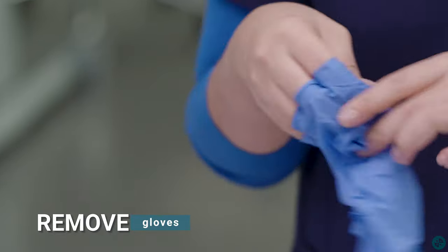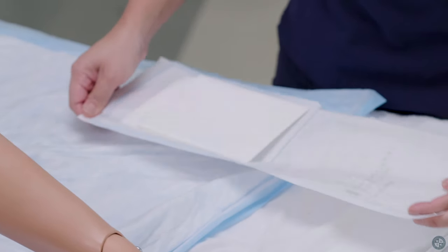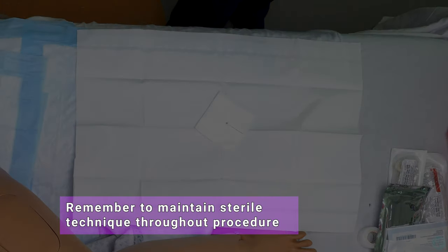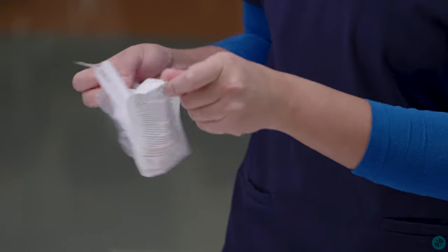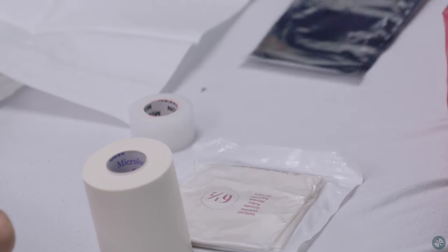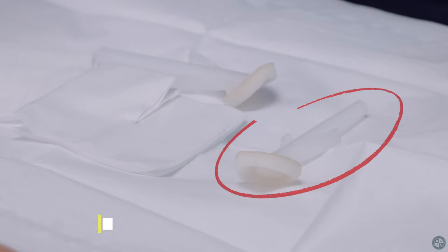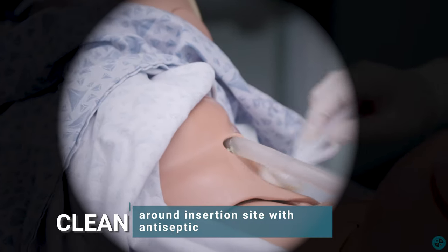Remove gloves. Perform hand hygiene. Set up sterile field. Remember to maintain sterile technique throughout the procedure. Open sterile xeroform petrolatum dressing and place it next to the sterile field. Don sterile gloves.